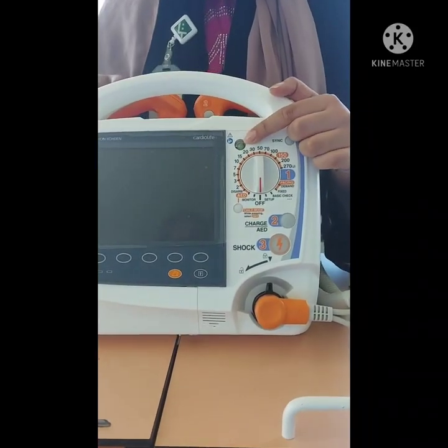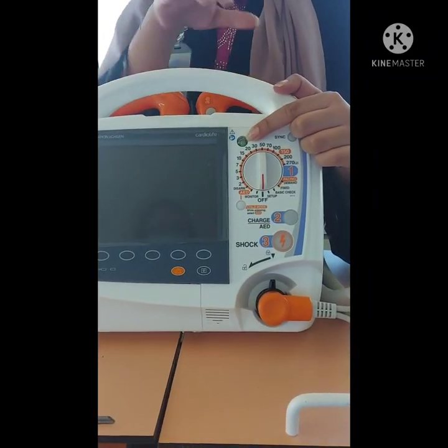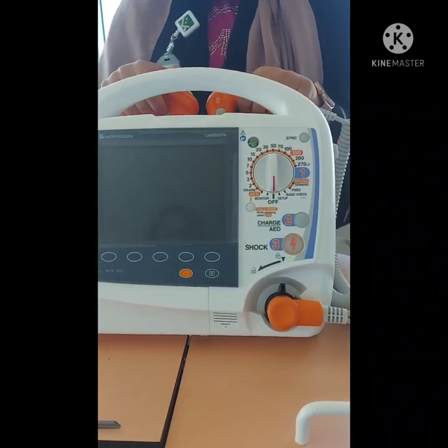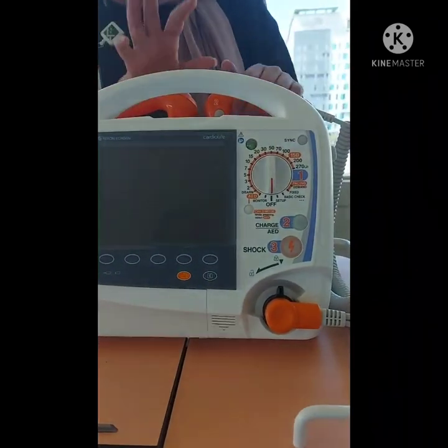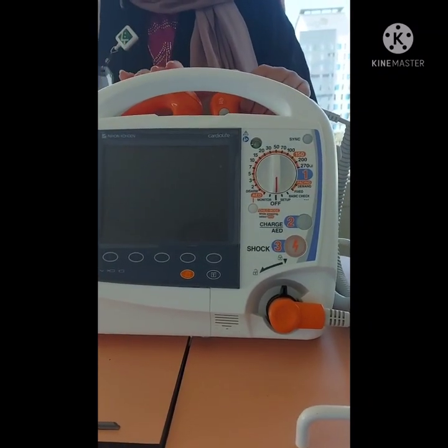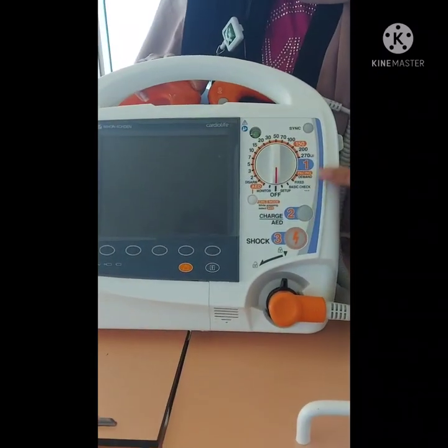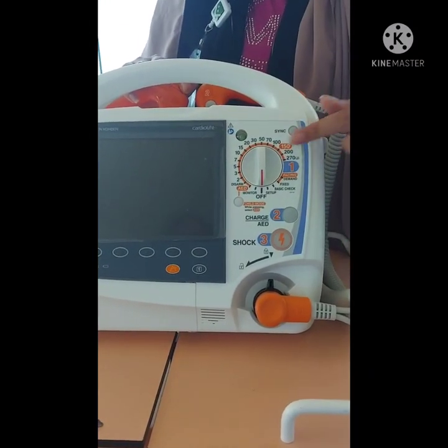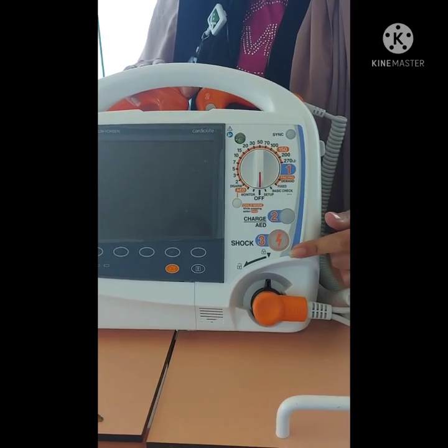Here you have the status indicator. It will be green if the defibrillator is ready to use and everything is fine. It will be red if there is something wrong with the defibrillator and it will not work. Here you can see 1, 2, 3, which is the basic step for choosing the joules, charging and discharging.